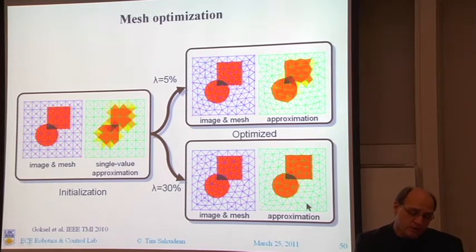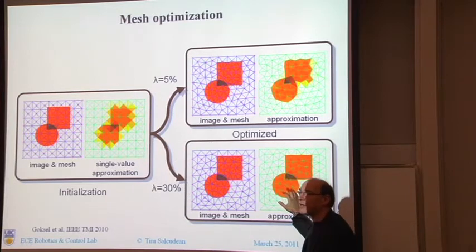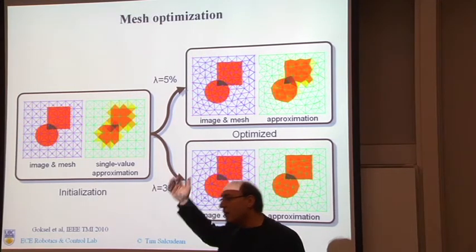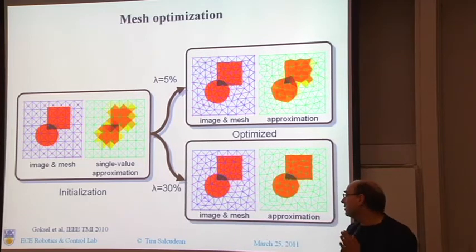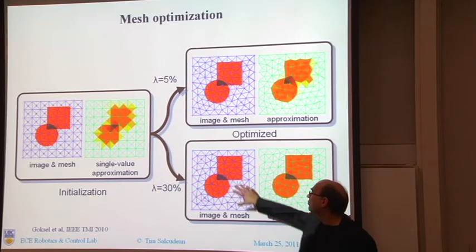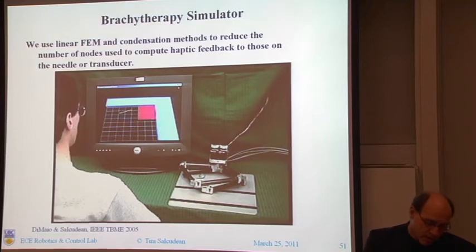So this is really terrific work, because you start with a finite element simulation and you're saying, what is it that I can compute at 200 hertz? I can do, I don't know, a 500 by 500 system at 200 hertz. So with that mesh size, what's the best match that you can get to the actual image? That's how we speed up the deformation.